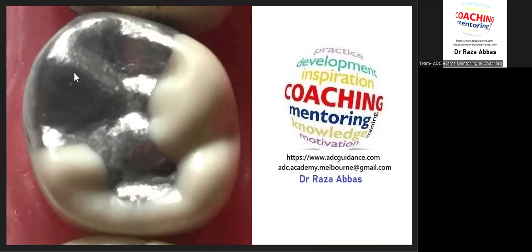Okay. Then, certain times candidates tell me that my cusp position is low. Please make sure to keep your cusp high, because you can always bring it down. But if your cusp position is low, you cannot increase it, right? So please always keep your cusp position at a high level and then bring it down gradually. Okay.